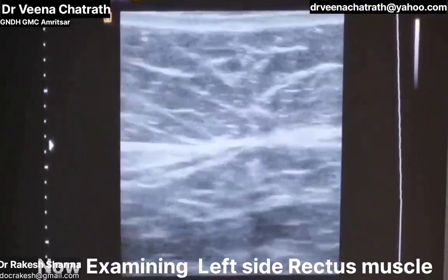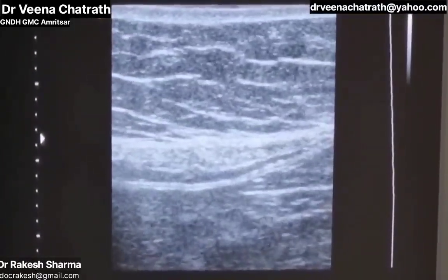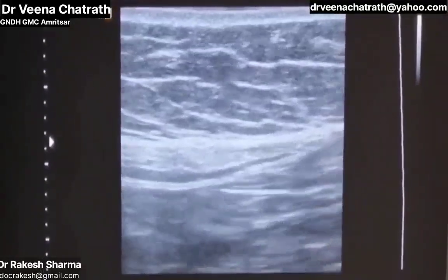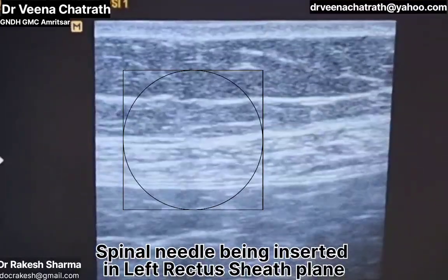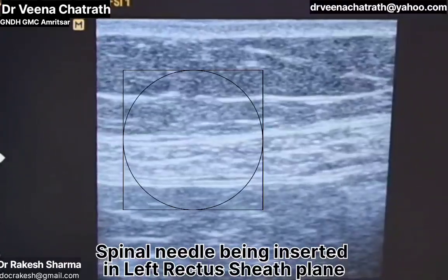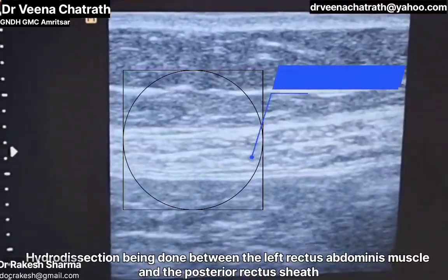scanning the left-sided rectus sheath muscle and the plane between the left rectus muscle and the posterior rectus sheath of the left side. We can see the position of the needle, and we will be confirming the correct position of the needle by doing hydrodissection with 2 ml of saline.